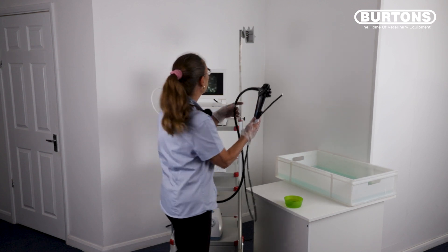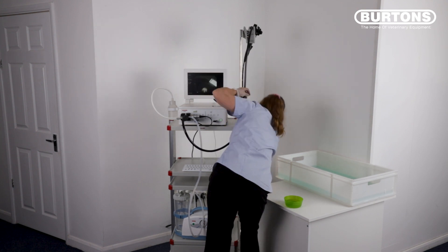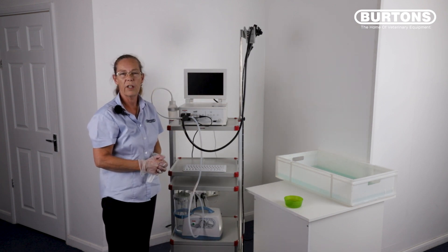You can now store the scope on the bracket, turn your equipment off and come back ready for cleaning and disinfection later.